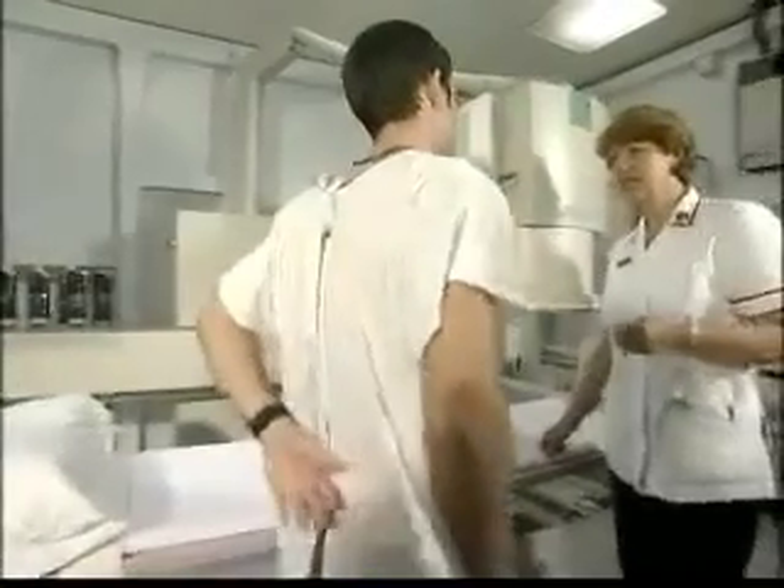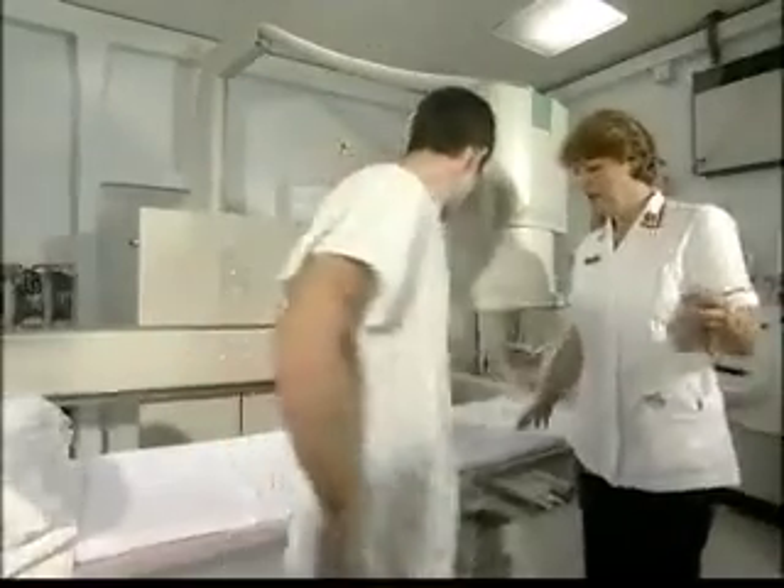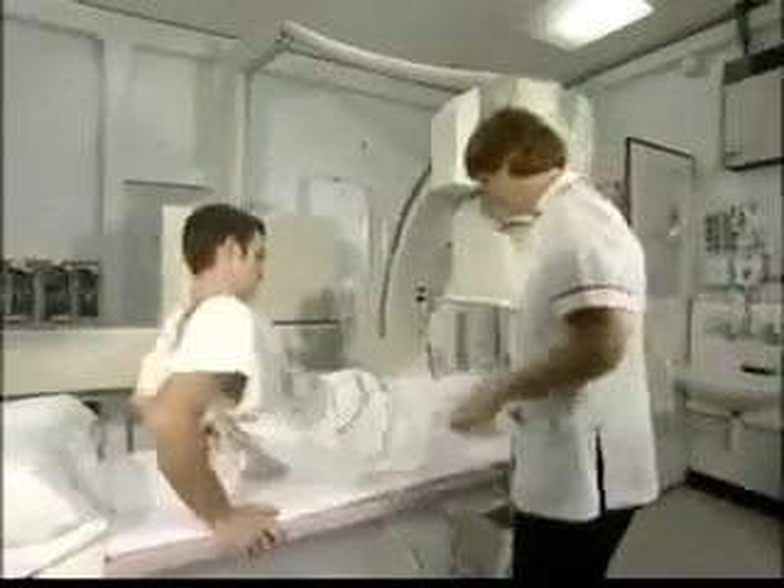I'm going to have a look at your arteries today. This patient needs an examination to look at the blood flow in his femoral arteries. This is going to be carried out using a technique called digital subtraction angiography.